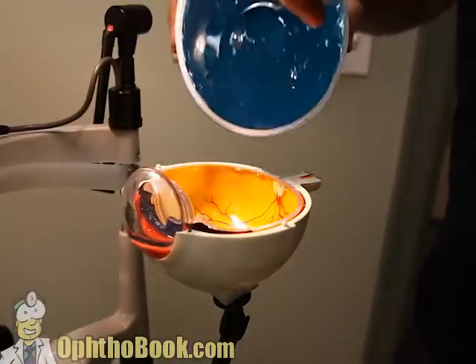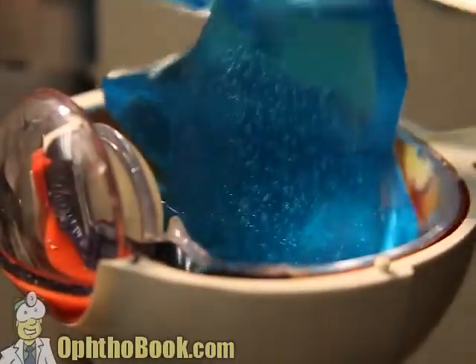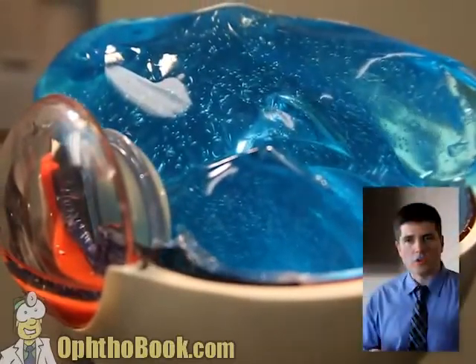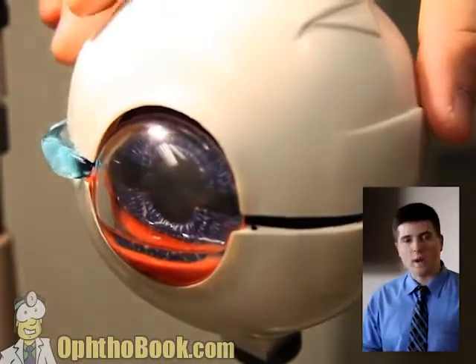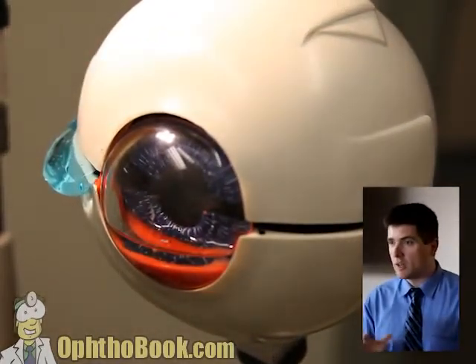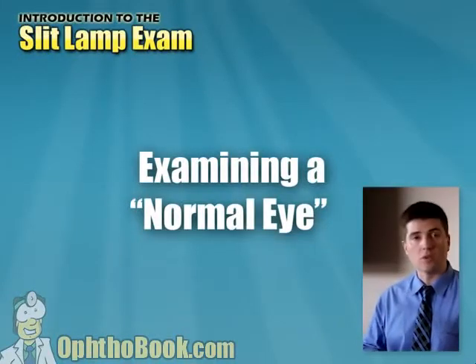As we know, the vitreous is filled with a clear fluid, very much like Jell-O or Jell-O dessert. But unless there's red blood cells, some type of retinal detachment, for the most part it looks like a dark space, at least with the anterior eye exam. And if we close it, you can see it's quite dark inside there. Okay, so the 8 structures, el ocho, we've learned it on the eye model. Let's move on to a normal eye, and we'll repeat ourselves and see what normal looks like.